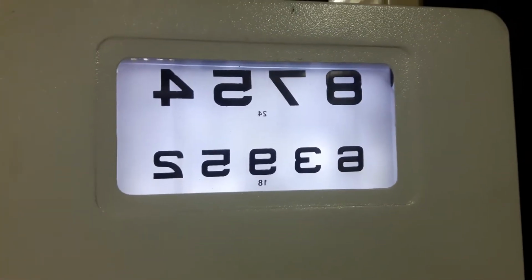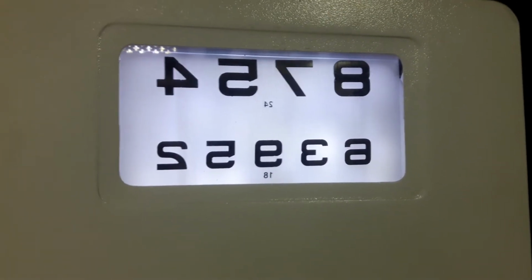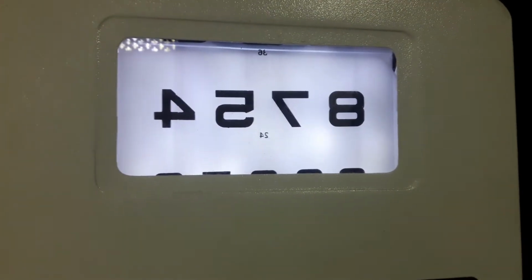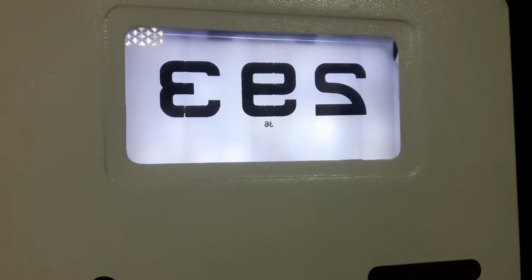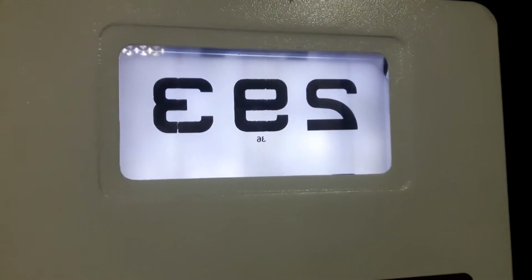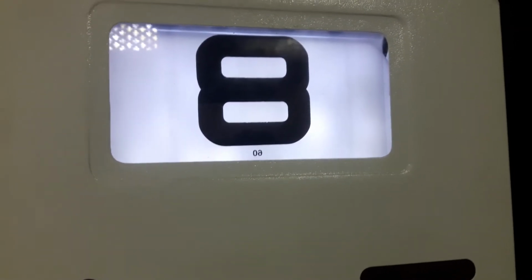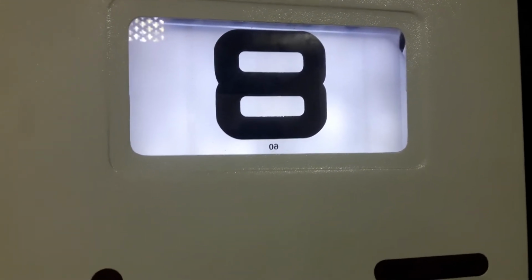If the patient is able to read the last fourth line only, then the vision is recorded as 6/18. If at all the patient reads only the top third line, then the vision is recorded as 6/24. If the patient is able to read only the first two lines, then the vision is recorded as 6/36. If at all the patient is able to recognize only the top first line, then the vision is recorded as 6/60.